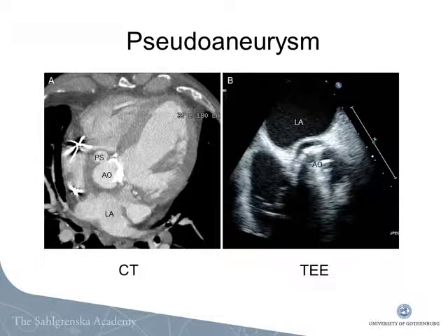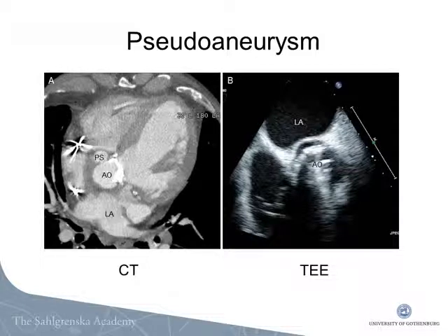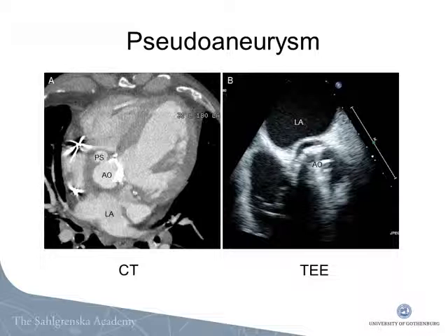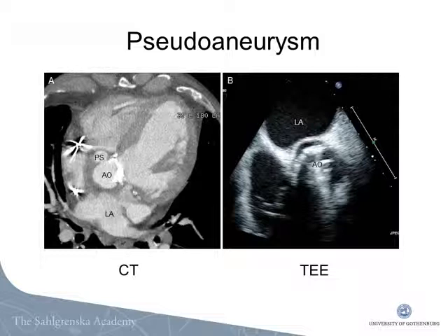This was one of the three pseudoaneurysms detected only with CT. The CT image shows a pseudoaneurysm situated anteriorly, close to the right coronary cusp marked with PS. The TEE image shows how the mechanical valve prosthesis gives rise to acoustic shadowing anteriorly — that is, down in the TEE picture — and the pseudoaneurysm cannot be detected.